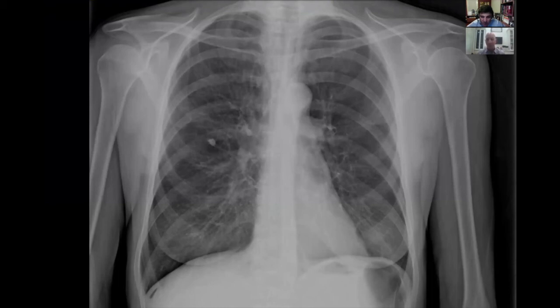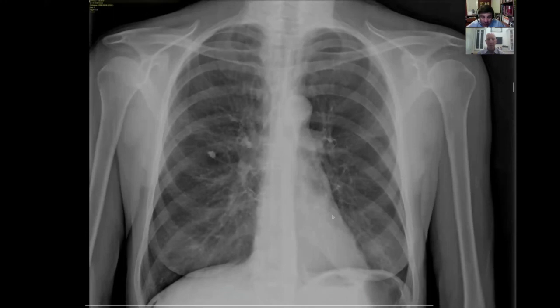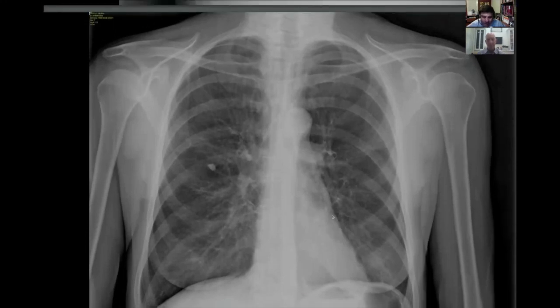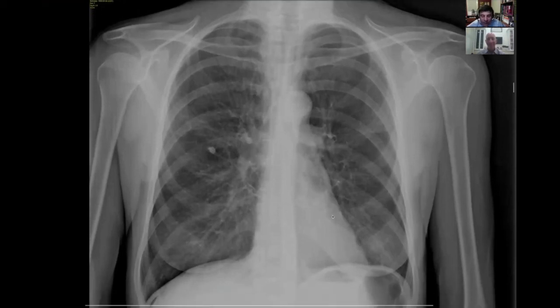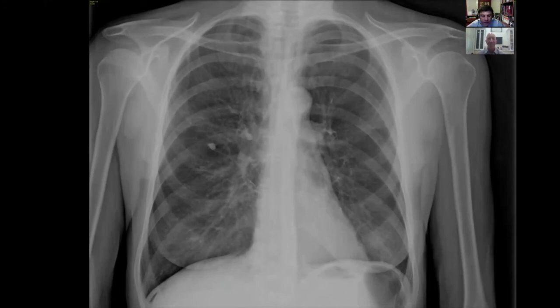Yeah, and to talk about technique, it's very important that you get the sulci of both costophrenic angles right there. Too often you see something get chopped off, especially if the lungs are hyperinflated, and you miss that corner, and it's like, do I really have to shoot it again? Yes, you need the entire lung fields, and you need to see the entire diaphragm. That's a perfect teaching case for adequate technique, how you need to get the entire lung field onto the screen.